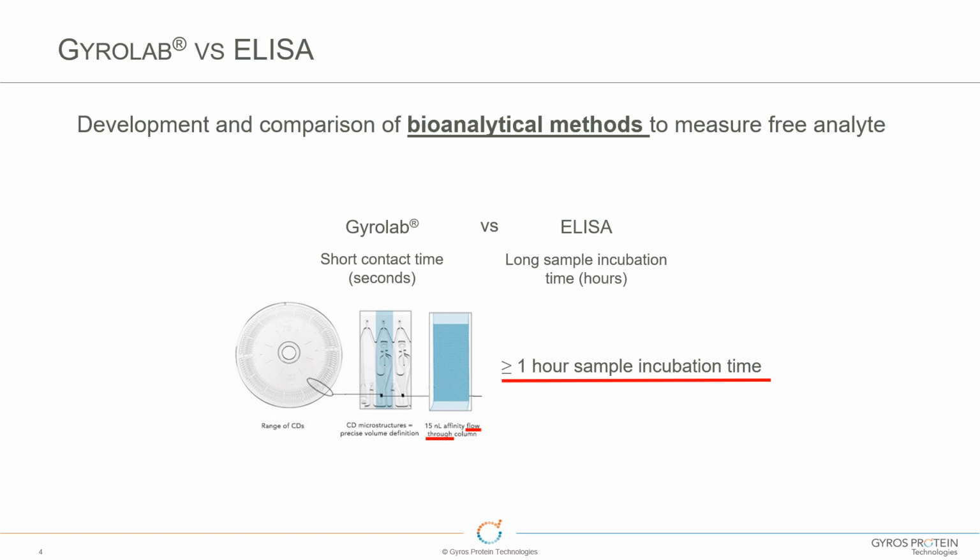It makes a lot of sense from a scientific standpoint. We think of the amount of drug that's bound to the target as a fixed thing, but it's a dynamic process, right? Exactly. It's always changing, and the minute you dilute the sample or put it in a new situation, it's going to re-equilibrate, and that's going to affect the results.